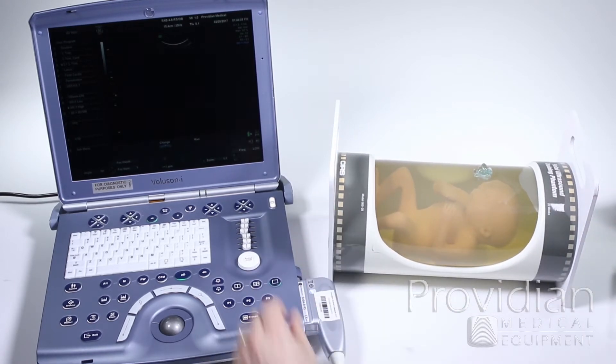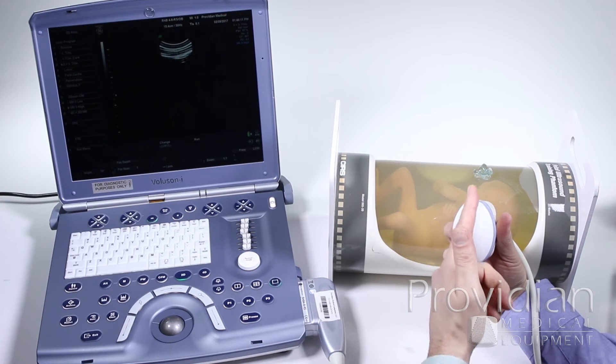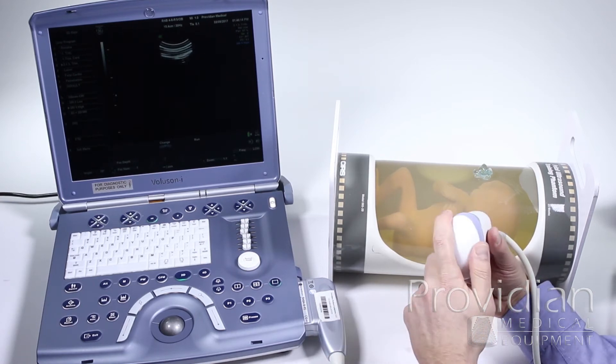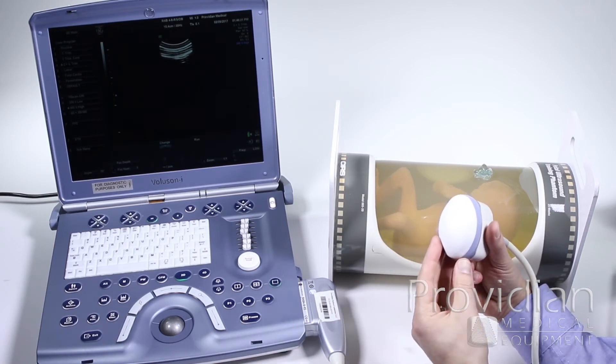When you're doing normal scanning, this probe right here is just like a standard ultrasound probe. The only difference between this and a standard ultrasound probe is the fact that this one can sweep back and forth, and we'll get to that in a minute.